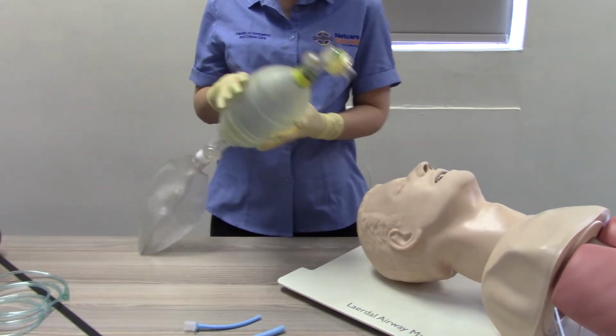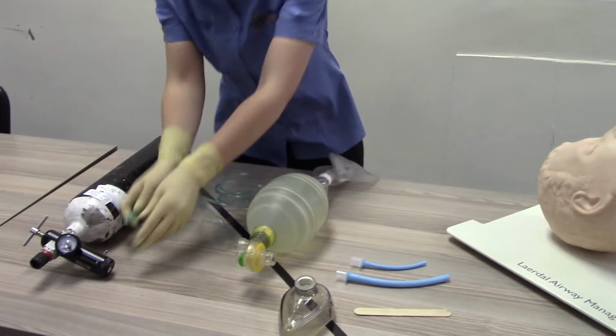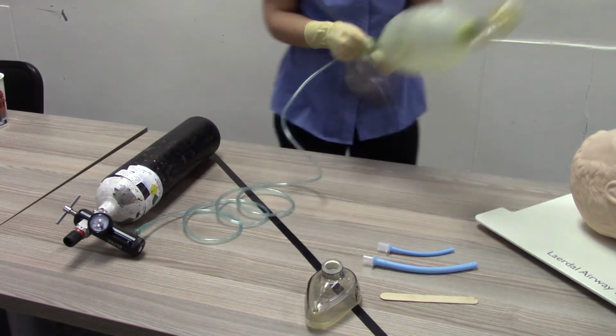Attach BVM to oxygen cylinder and open oxygen cylinder to 10 to 15 liters per minute.